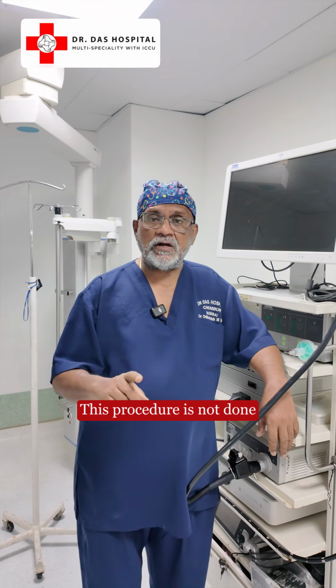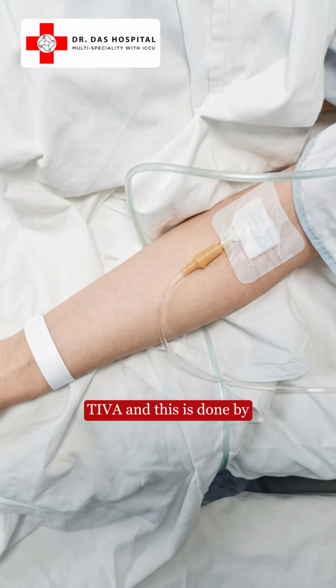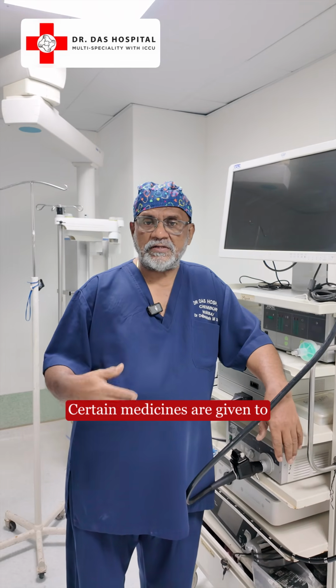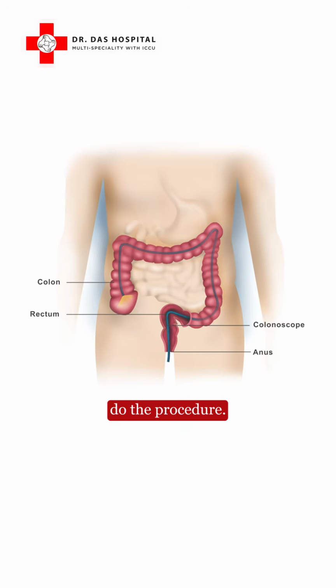This procedure is not done under local anesthesia. We administer total intravenous anesthesia, which is also called TIVA, T-I-V-A, and this is done by an anesthetist. Patient is admitted in the morning. Certain medicines are given to clear the large intestine because you need a clear field when you have to see the intestine, and then you do the procedure.